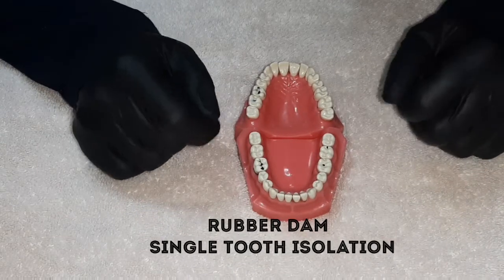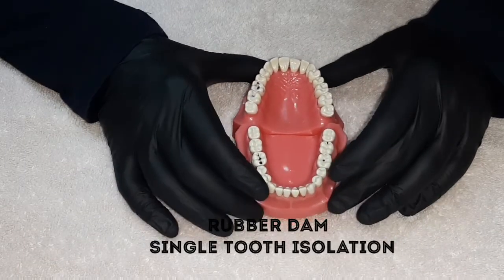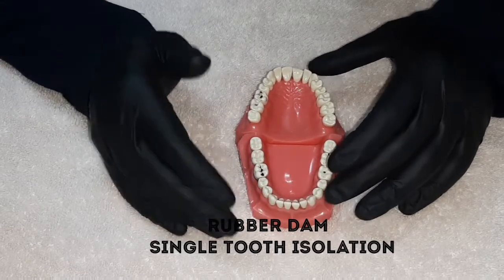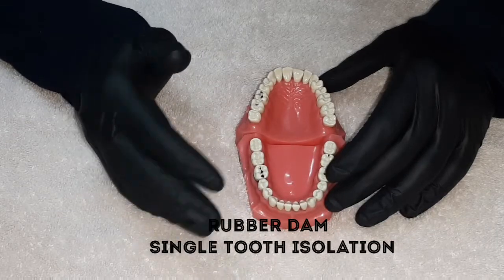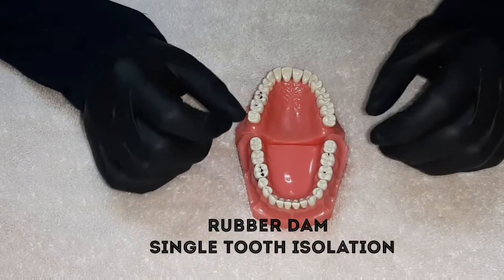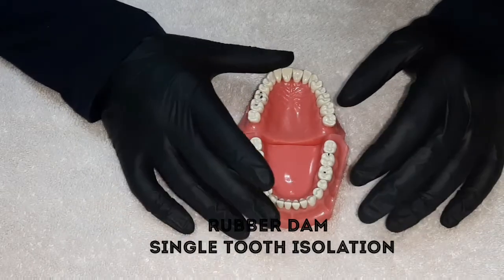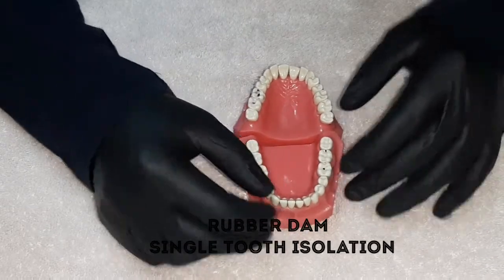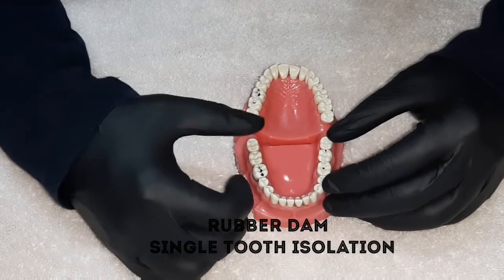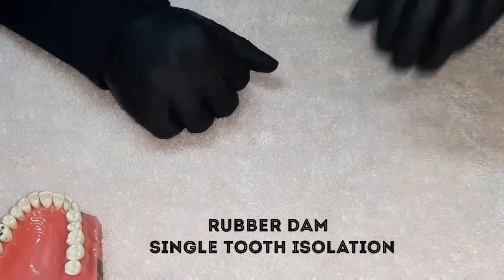I assure you that once you have started using rubber dam, it will become difficult in the initial phase, but as you practice more with every single endodontic case and restorative case, things will become very easy. Isolation of a single tooth — the time-consuming part — will reduce to around one minute or less. The only difficult part about using rubber dam is convincing a dentist to use them. Rubber dams have been in dentistry for over a hundred years.